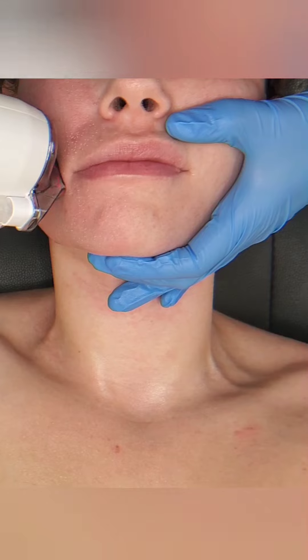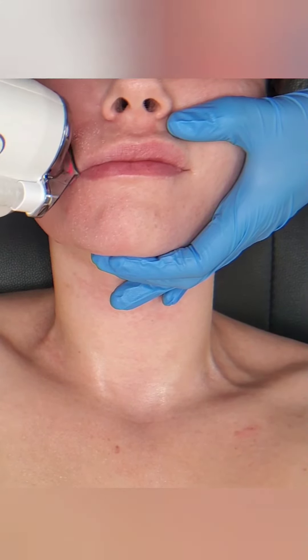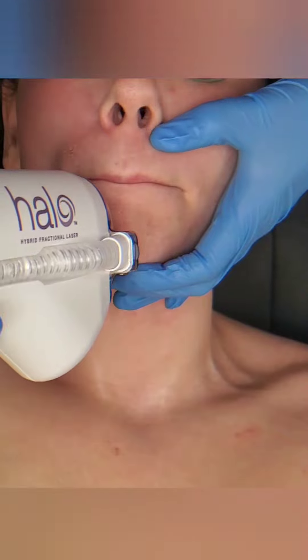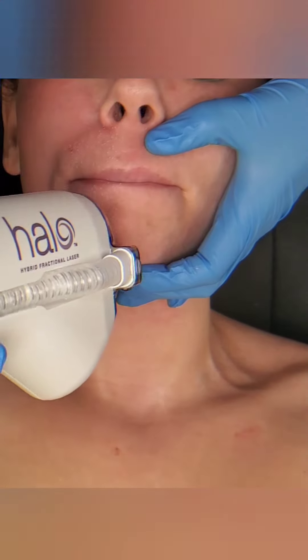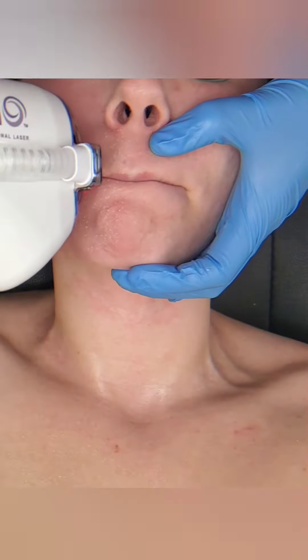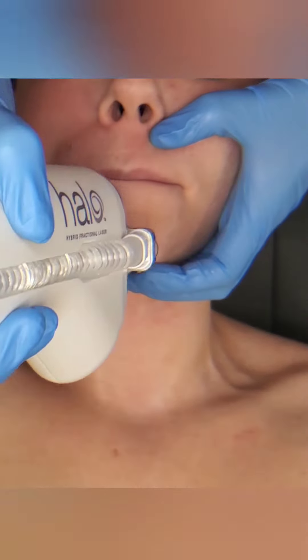You want to use very gentle products and nourish that skin for at least one to two weeks after your Halo treatment. I like to tell patients to wait until you're completely done peeling. Some people are late peelers — they may not peel until between five and seven days, which is not uncommon. Expect to be red for at least two to four days.